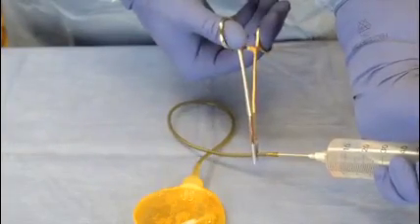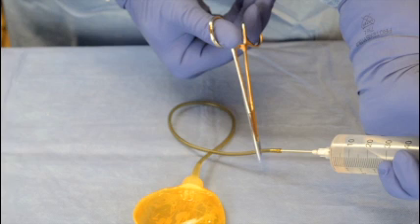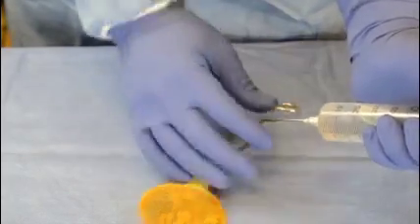While maintaining upright pressure on the syringe plunger, clamp the reservoir tubing using a blue shod mosquito hemostat about 1 inch below the needle. Do not advance the hemostat's ratchet more than 1 notch. Remove the tubing from the needle.